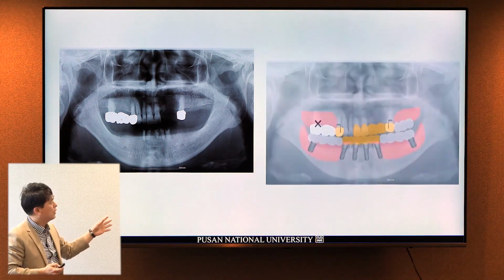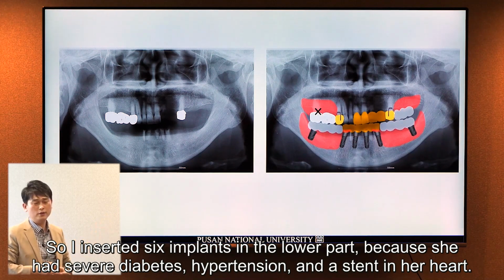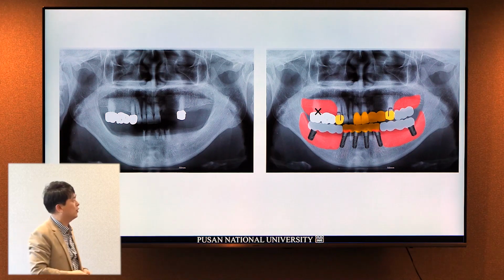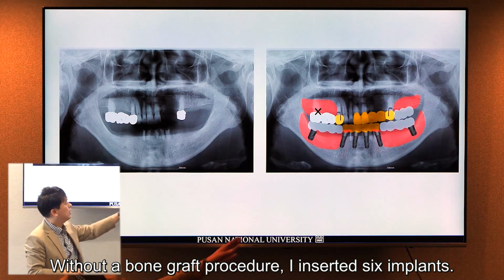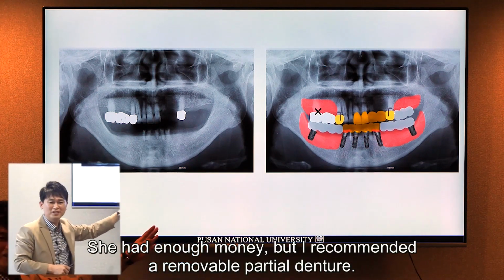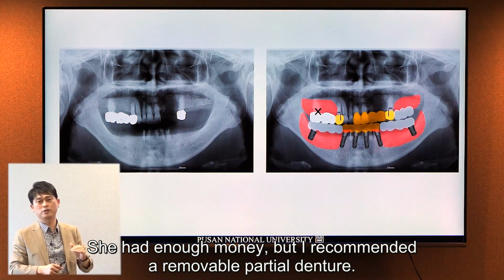I inserted 6 implants in the lower part because she had severe diabetes, hypertension, and a stent in the heart. So without a bone graft procedure, I inserted 6 implants. She had enough money, but I recommended a removable partial denture.